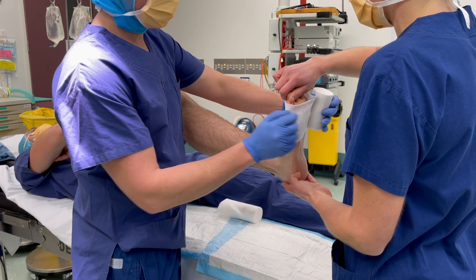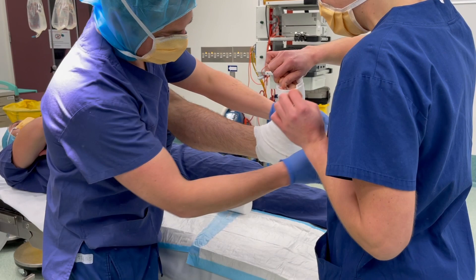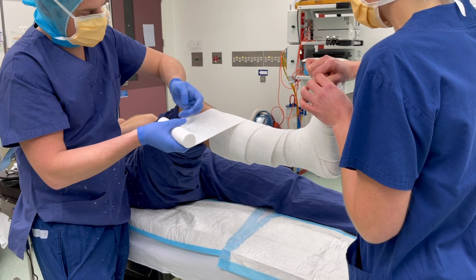With the help of an assistant holding the toes, we apply the 10cm softband going from distally, overlapping 50% at a time, with additional reinforcement around the heel and malleoli to prevent pressure injury. This is followed by a further 15cm softband to complete the rest of the leg.